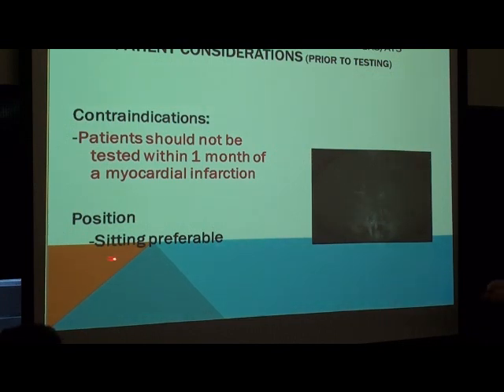ATS does allow for this test to be done in a standing position as well, but clearly, from my perspective, from a safety perspective, sitting is where we want to go. We really don't want the patient standing. We've done it under some very, very unusual circumstances, but, and we'll talk about this later, spirometry carries an attendant risk of syncope or near syncope, and in that condition, the patient can become unstable. If they're standing, then they're a fall risk. Really don't want that.